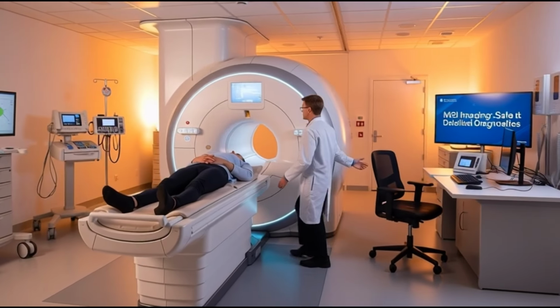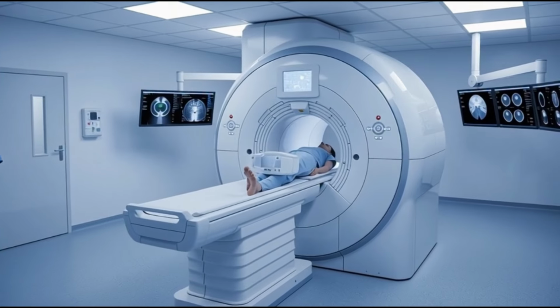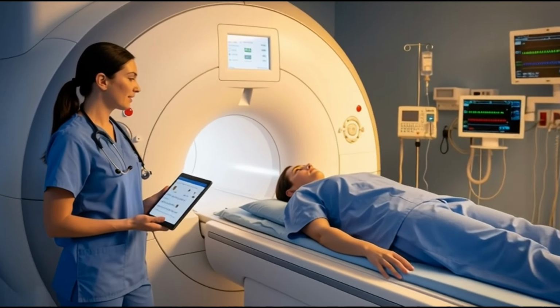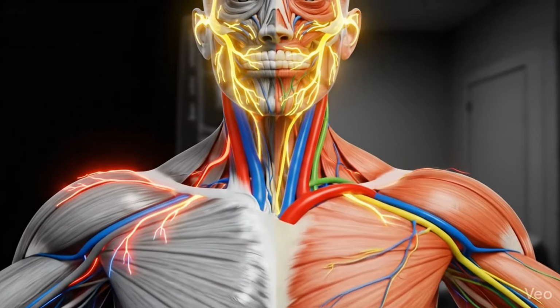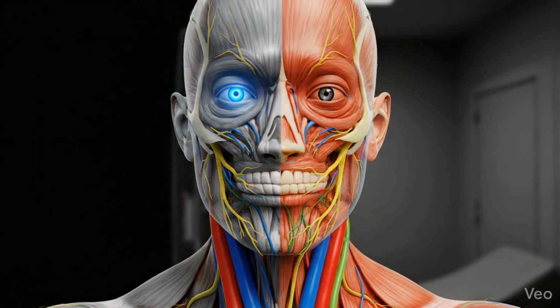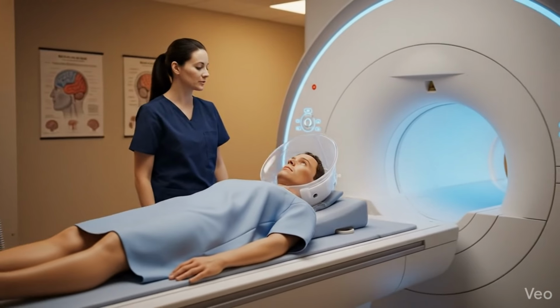Before the scan begins, the patient is positioned comfortably on the MRI table. The specific body part to be examined is placed inside the magnetic field. Specialized coils, such as head coils or body coils, are used to improve image quality. The table then slowly moves into the MRI scanner.